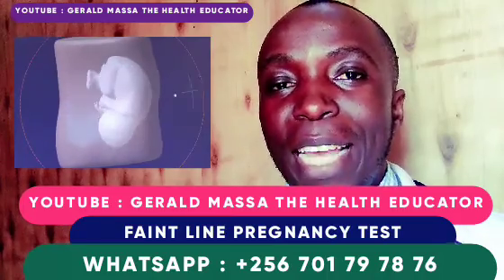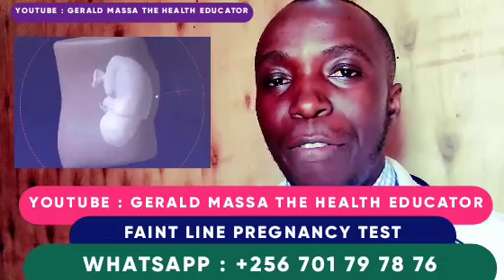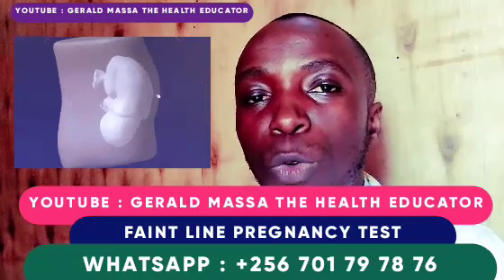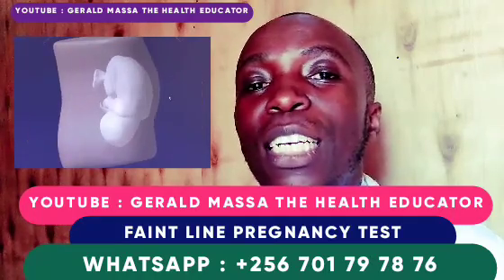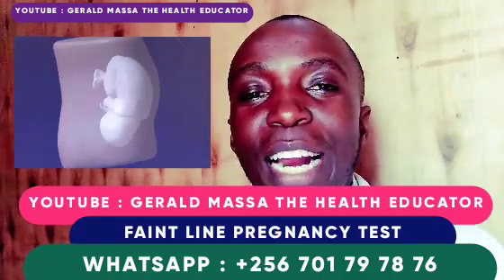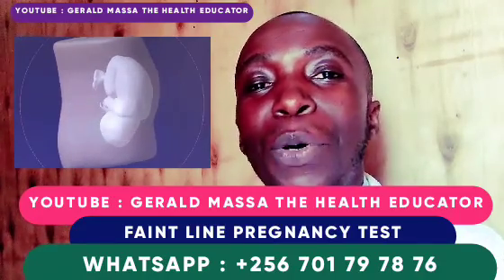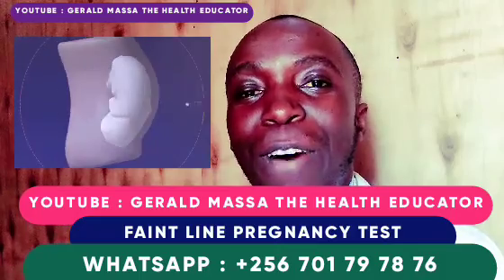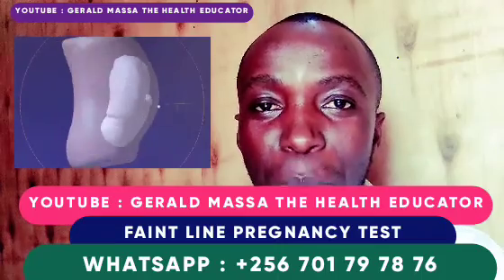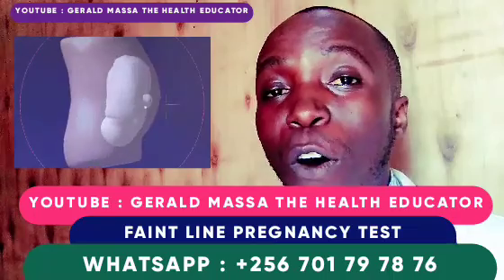I hope by the end of this lesson you have learned about pregnancy test, you have learned about a faint line, and you have learned that when you see a faint line, you should not worry. This is a confirmation that you could actually be pregnant, but the levels of the HCG hormone, the pregnancy hormone, are low. Or you could be taking some drugs, for example, antidepressants, and even drugs for anxiety, or drugs for allergies, and at the same time you are doing the pregnancy test. It could mean that you are taking these drugs and they are affecting your hormonal levels.